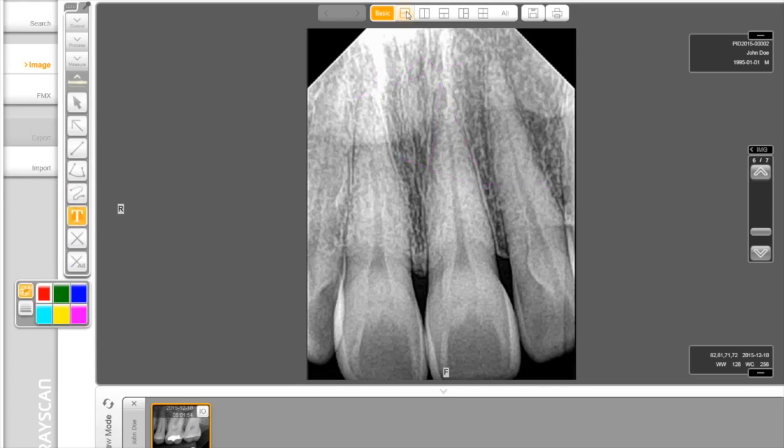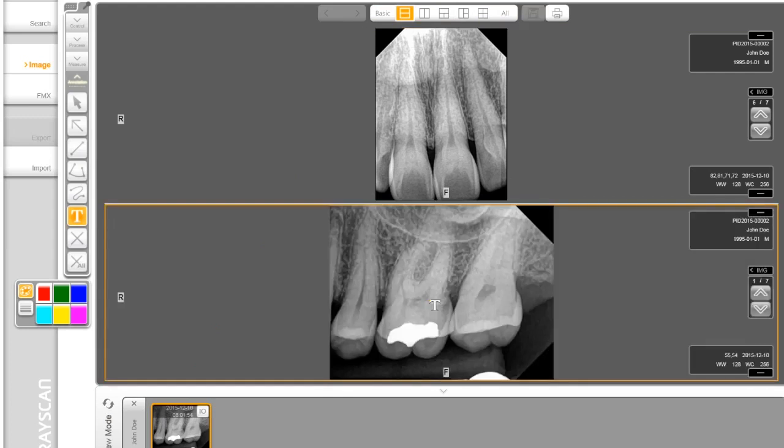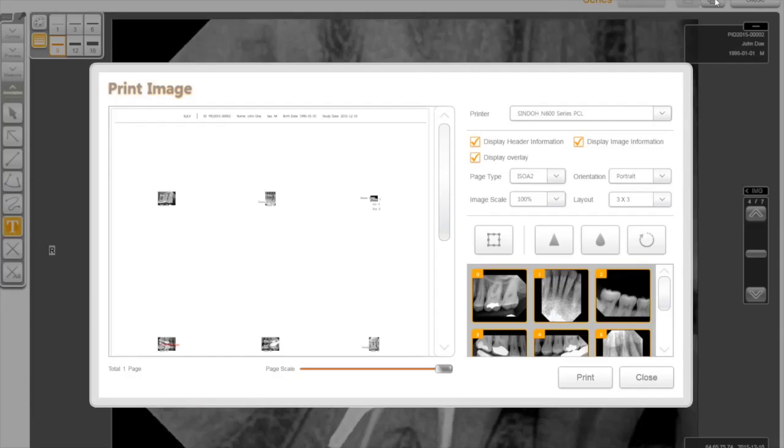The Compare Images function allows a user to view up to 5 images in a side-by-side comparison window. This tool allows a drag and drop function. If you decide to save the adjustments, click on Save. Also, you can print by going to Report.